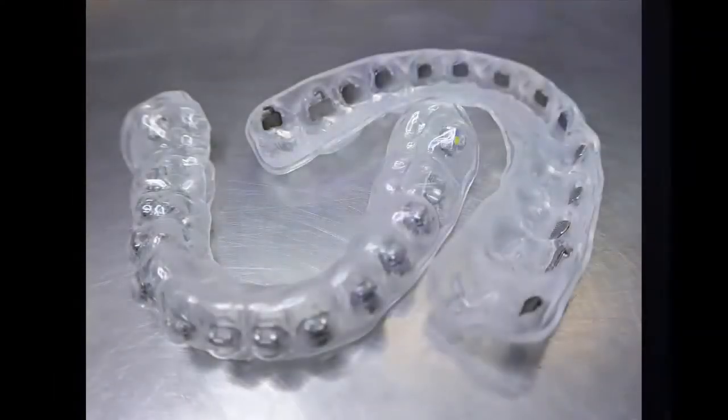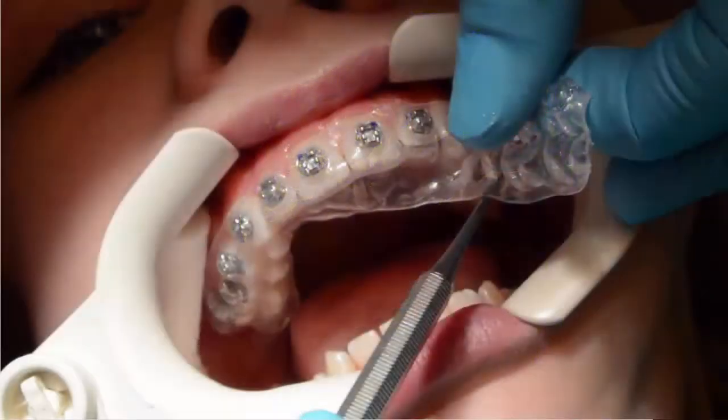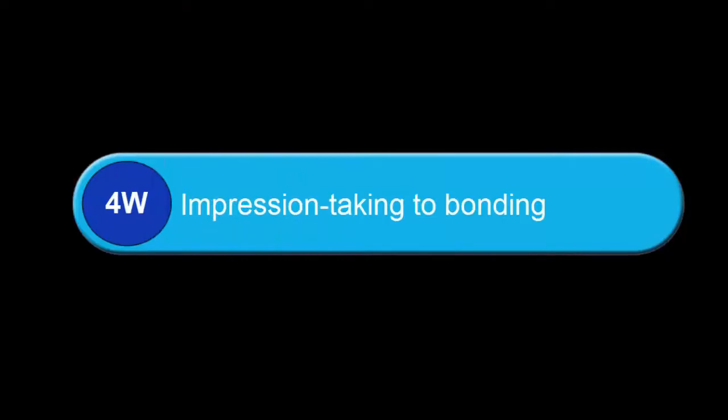The following video provides a step-by-step guide to chair-side bonding of the XSEED bracketing trays. To ensure trays fit, the interval between impression taking — whether digital or analog — and bonding should not be more than 4 weeks.